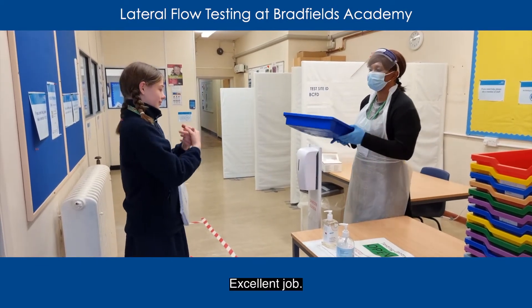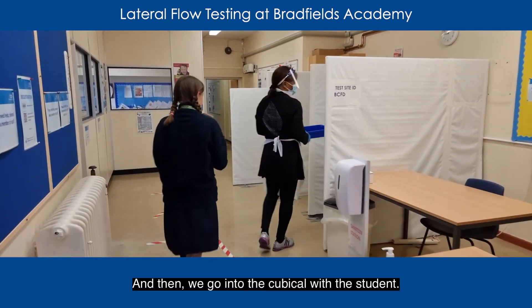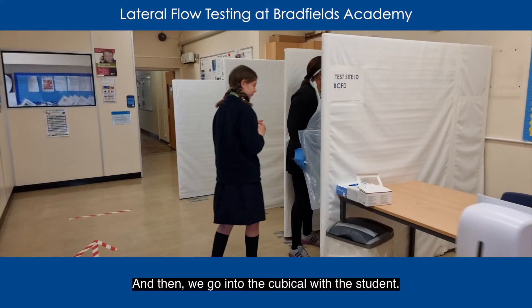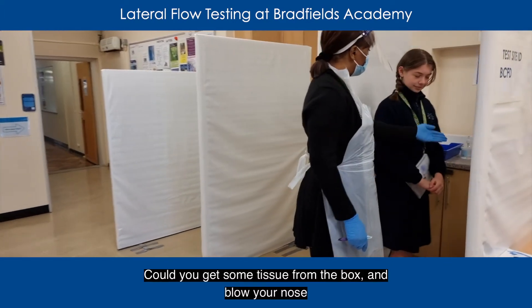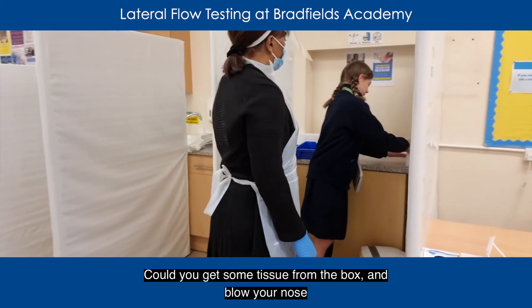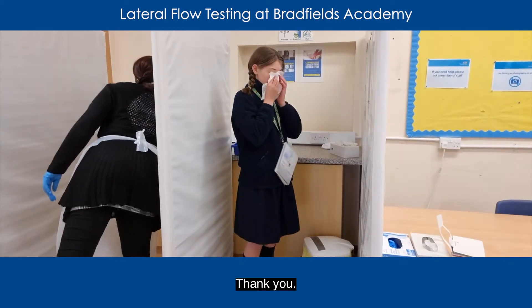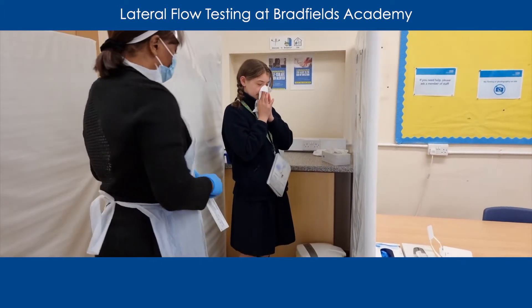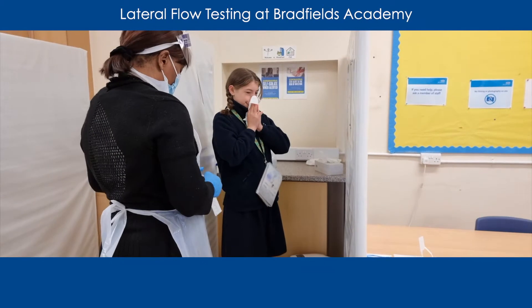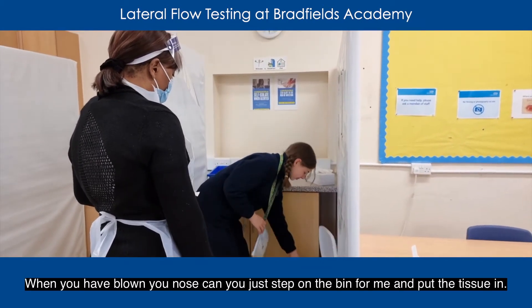Then we'll go into the cubicle with the student. Step in, thank you. Could you get some tissue from the box and blow your nose. Thank you. And blow your nose. Can you just step on the pedal bin for me and put the tissue in.